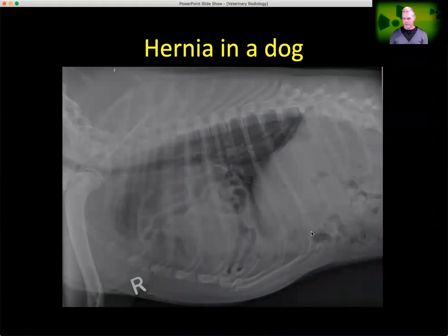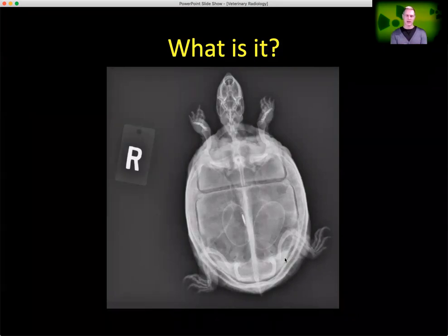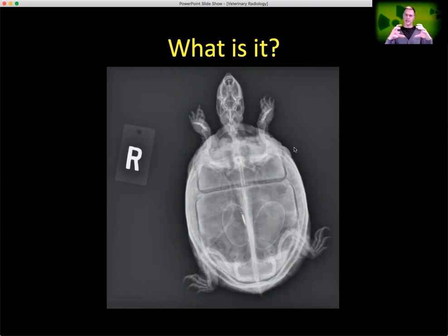Do you ever radiograph them upside down, the turtle? Well, the reality is I don't know if this turtle is on its back or on its belly, probably on its belly, to be honest, because it's just easier. And the image itself would actually look the same, whether we looked from one side or the other, because it's a radiograph, we're compressing that 3D into a 2D image. So it would look the same either way. We do radiograph them from the side as well, and also from the front, so we can look at symmetry from that perspective as well, because they do have lungs that are up in the dorsal part of their coelomic cavity. And so if we were to look at them sort of from the side or head on, we can actually see those lungs separate from the rest of their abdomen.